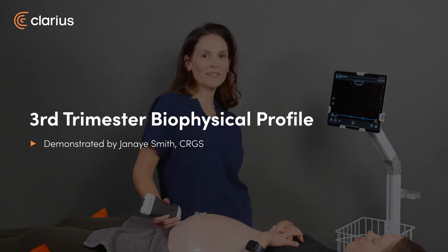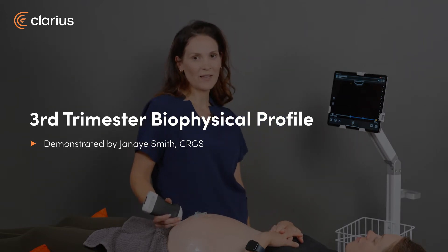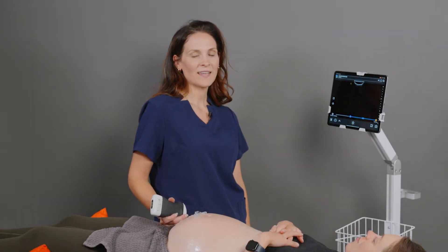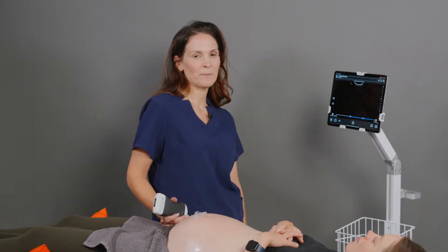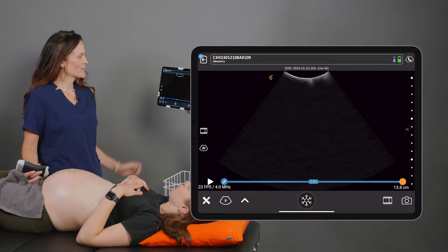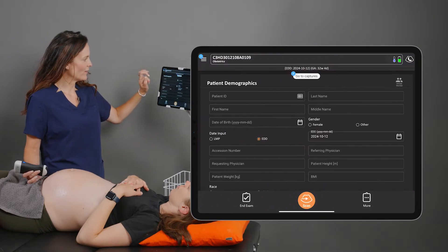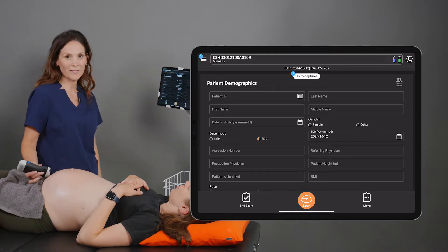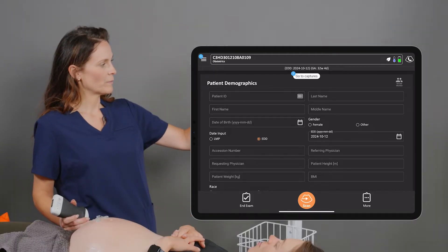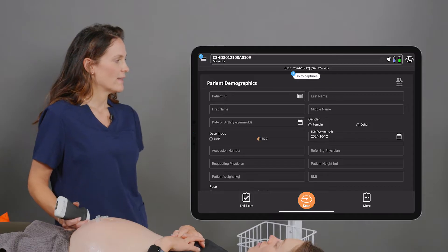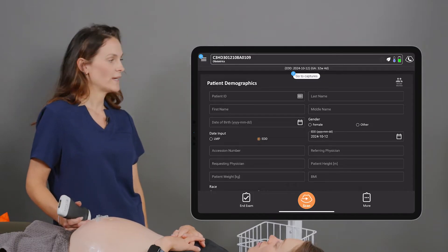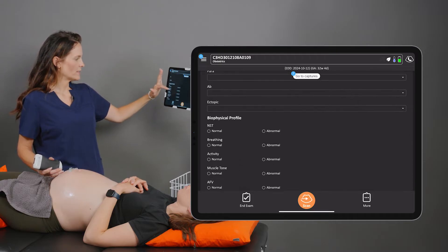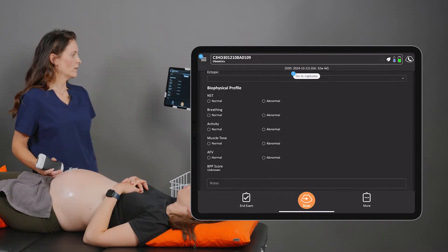Hi, I'm Janae, and today we're going to be demonstrating the ultrasound components of the biophysical profile scan. This scan is done in the third trimester and it demonstrates fetal well-being. On the patient demographics page, I've already entered the patient's due date based on her dating ultrasound. Displayed at the top of the screen, we can see that this baby is 32 weeks and four days today. If we scroll down the demographics page, we see the component for the biophysical profile.